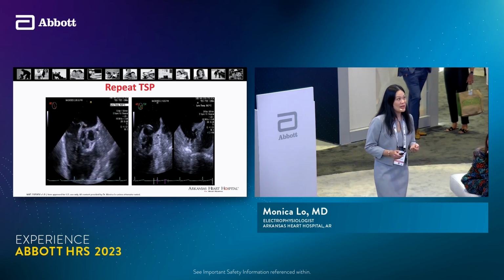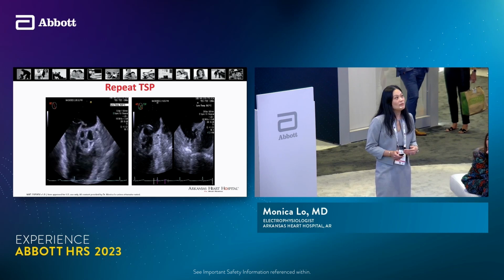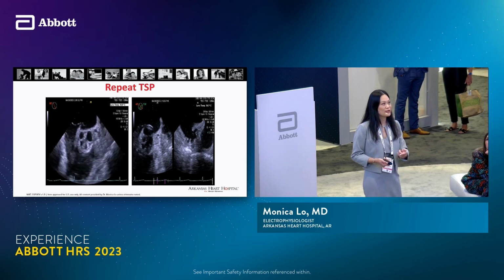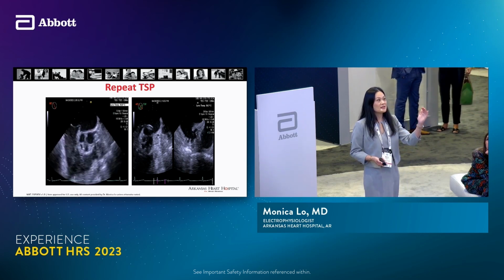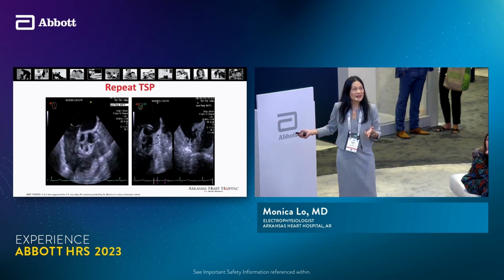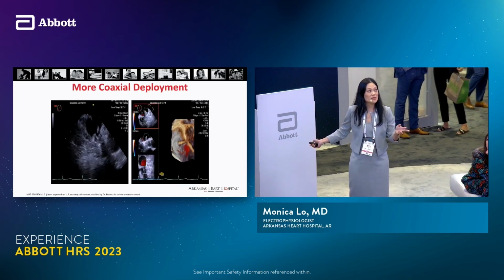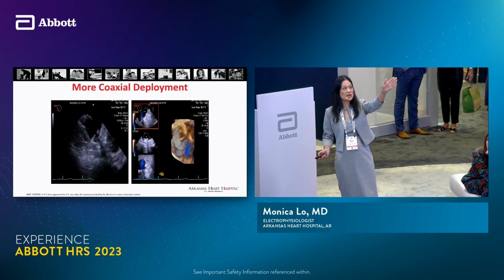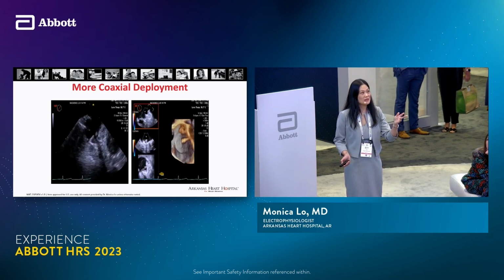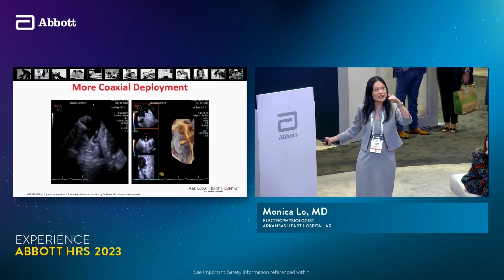So you see the left panel, the needle is actually kind of pointing towards the aorta. But when I pushed the sheath over, I clocked so that the sheath is not pointing towards aorta. And actually, it's a lot more coaxial when you pan over into the left atrial appendage. But this is very anterior. But I think it was the only way to be able to deploy so that my sheath is not hitting against the ridge. And really, without Amulet, I don't think that there was another device that would kind of sit in that lobe and cover the os.